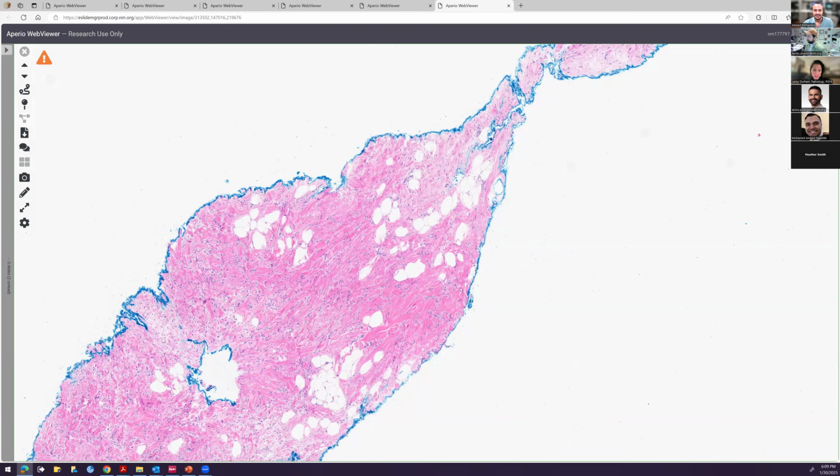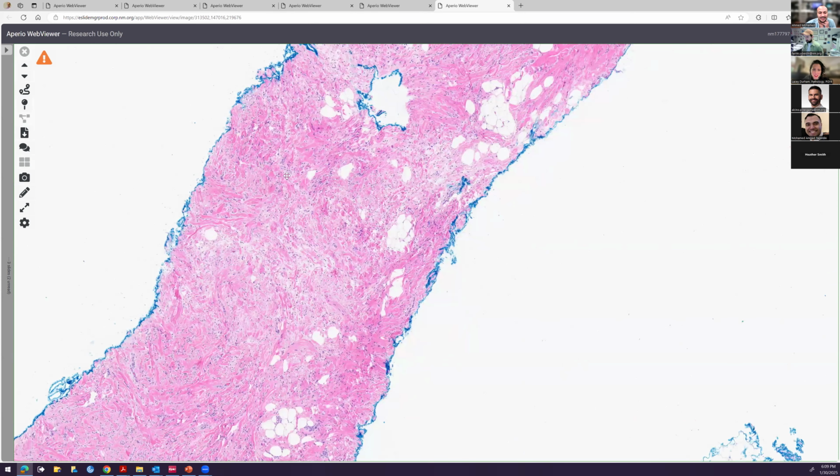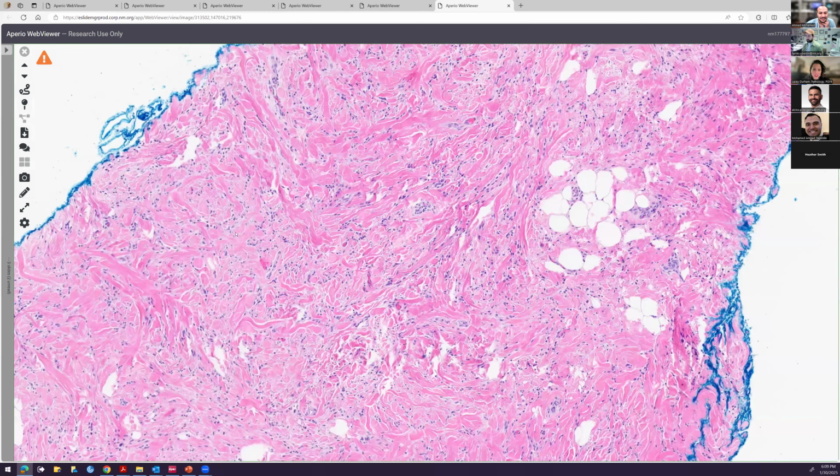Circumscription wise, I guess. Yeah, looks infiltrated. Yeah, it's kind of ill-defined, right? There's fat throughout this thing, so it's a little infiltrative. Okay. Let's talk about sort of architecturally what we're looking at here and maybe the background.